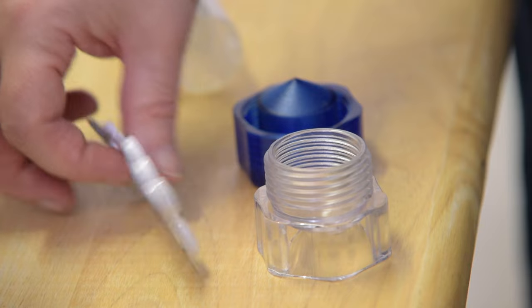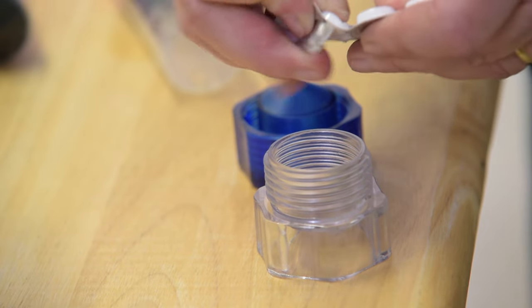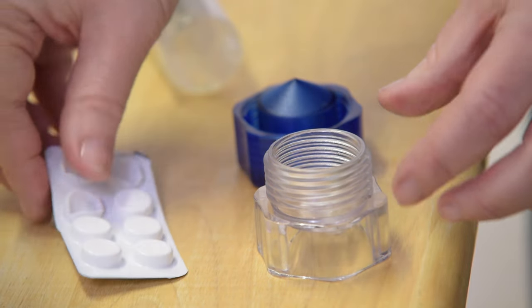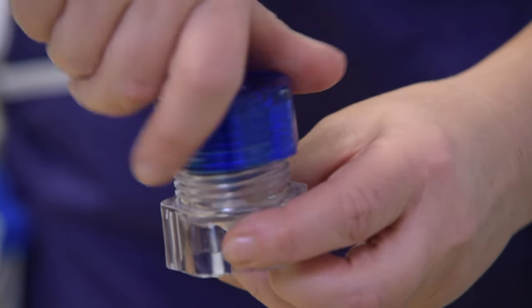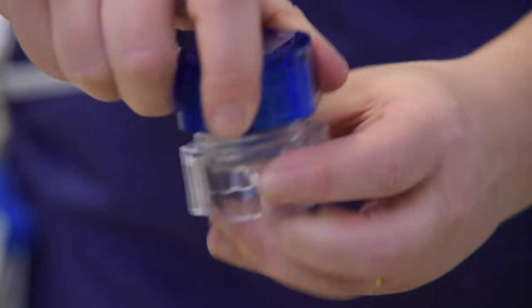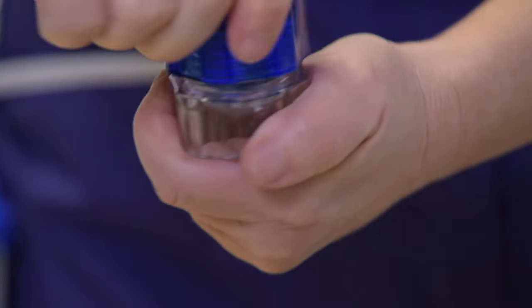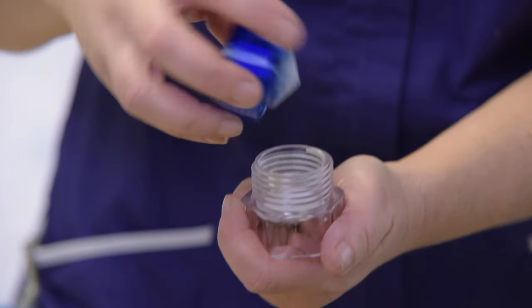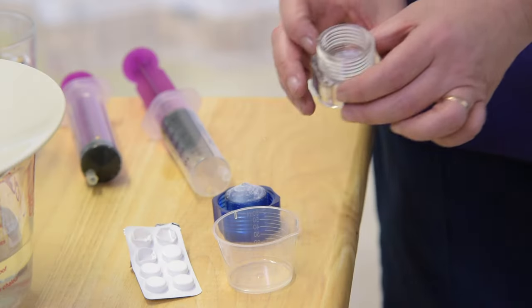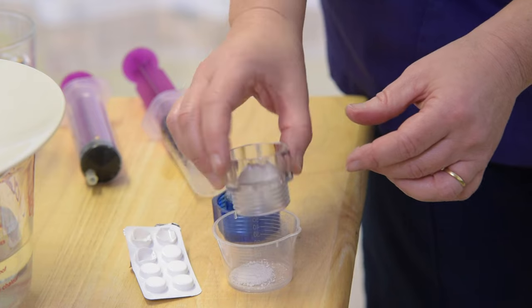Place the tablet in the tablet crusher. Turn the crusher lid clockwise until it will not turn any further. Unscrew the tablet crusher and ensure all the tablet is crushed into a powder. Repeat this process if not.